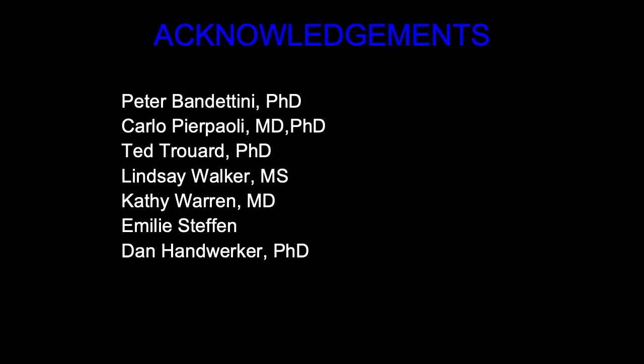Initially, people thought that the T2 would be faster at 7T, so the echo times wouldn't be as much of an advantage. But when we first got a 7T, I did a comparative study, and it's better SNR. Maybe not as much better for fMRI, but it is better than at 3T. And if we get some fancy gradients on one of the 7Ts, then, yeah.